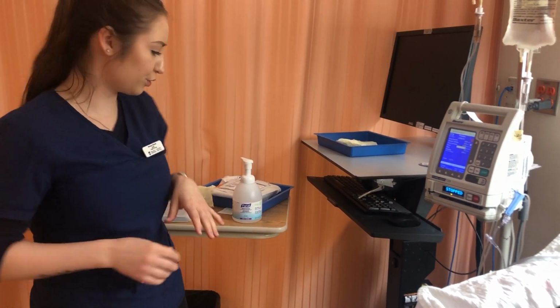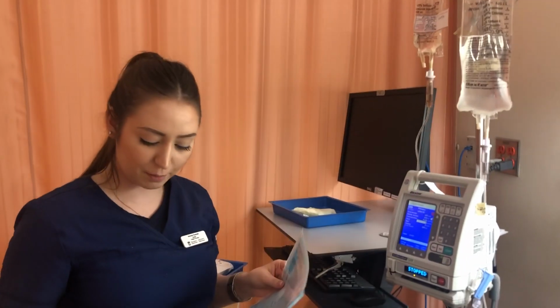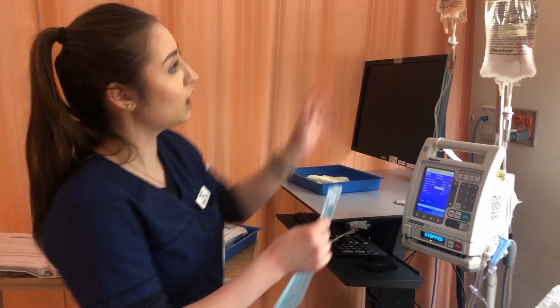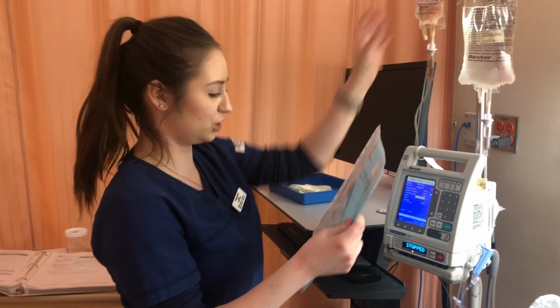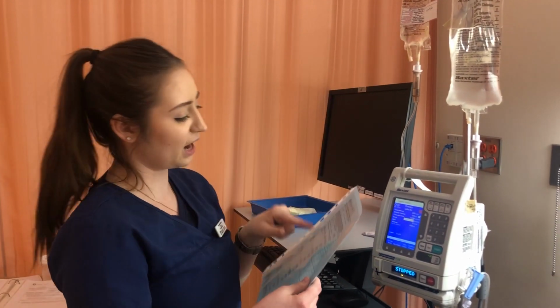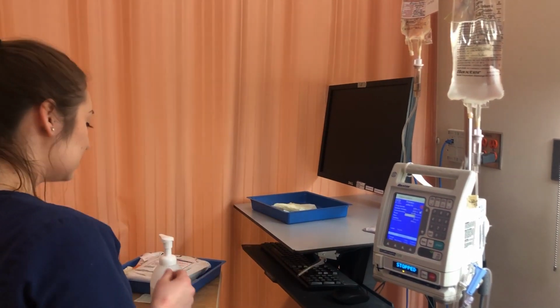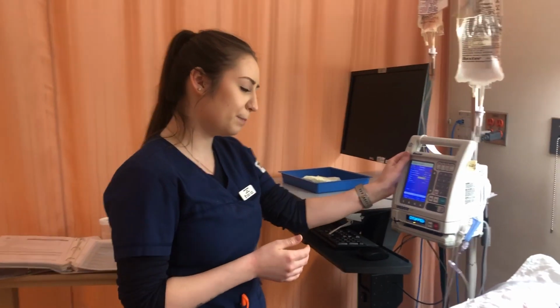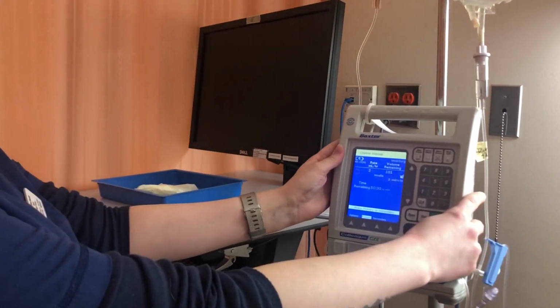So we're going to go through the MAR compared to the mini bag, compared to my patient's armband together. So right patient is Bryson Scotlan. Right drug is Insulin Humulin R, which is what I have. Right route is continuous IV. Right dose is 2 units per hour, and that's put in there correctly. And right time is now. So once my buddy nurse agrees that this is all correctly set up, I can press start on the pump. So I'm going to confirm primary and press start.